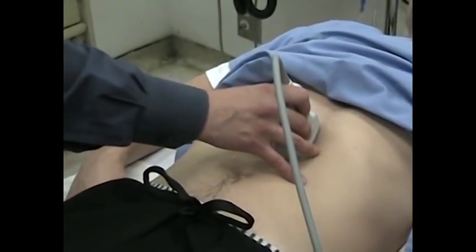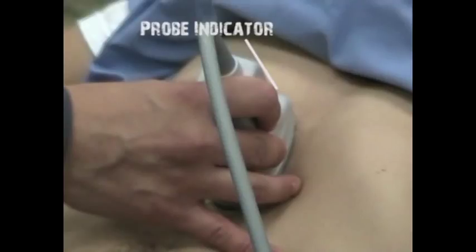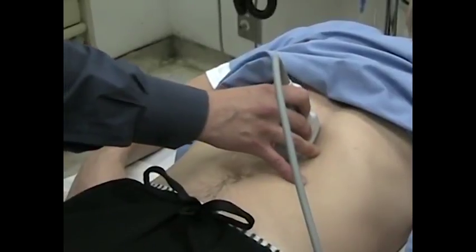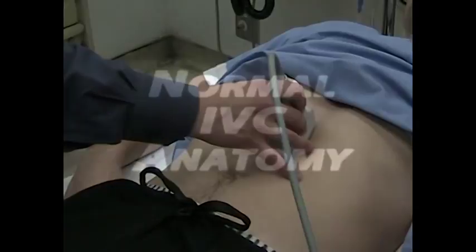All right, so what Danny's doing here is he's just taking a curvilinear 3 to 5 megahertz probe. He's aiming the indicator towards the head. He's placing it just under the xiphoid process, and then he's just sliding 1 to 2 centimeters to the patient's right. So that's the deal. Probe goes just under the xiphoid. Slide 1 to 2 centimeters to the patient's right, and just tilt towards the heart.